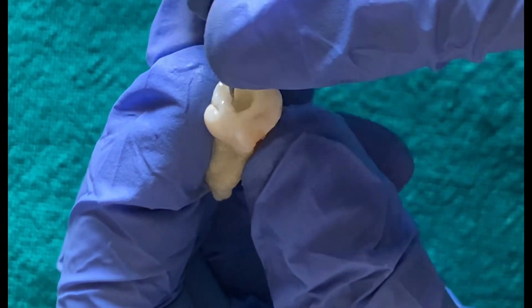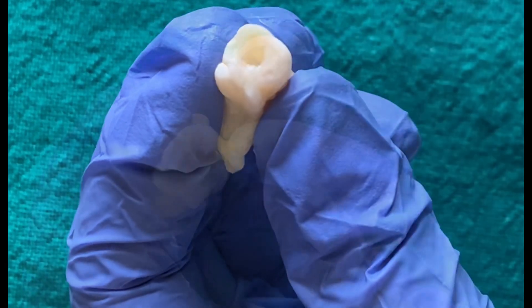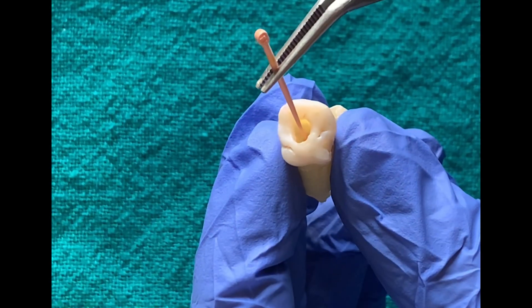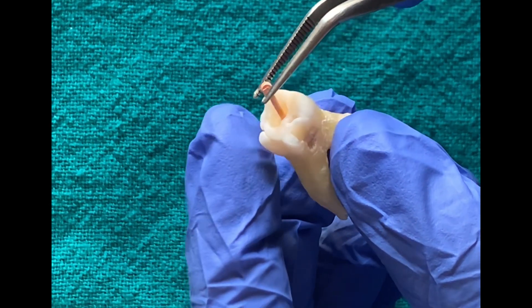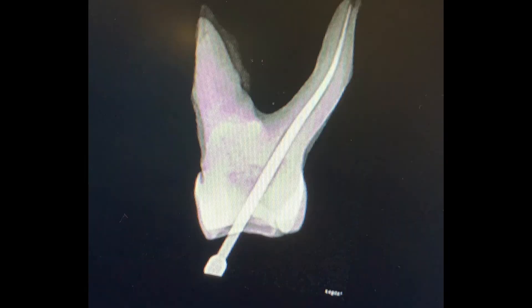Generally, only one finishing instrument is required to prepare the apical one-third of the canal. I take a gutta-percha cone matching the finishing instrument used, which was F1, and place it in the canal. I observe that there is a snug fit in the apical area. To confirm this, I take a radiograph. The radiograph shows that proper apical seal has been achieved, and we can proceed to obturation of the root canal.